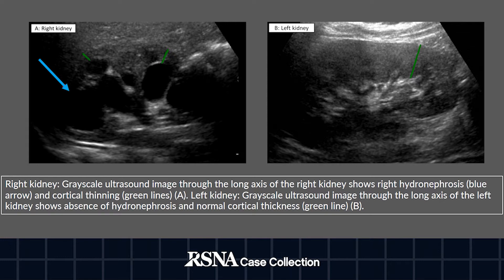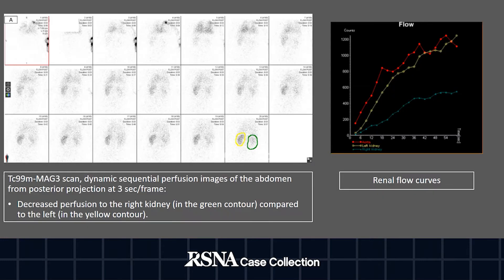The patient was referred for a MAG3 renal scan. The perfusion phase of the MAG3 scan at 3 seconds per frame shows decreased perfusion to the right kidney in the green contour and normal perfusion to the left kidney in the yellow contour, and this reflects in the renal flow curves.